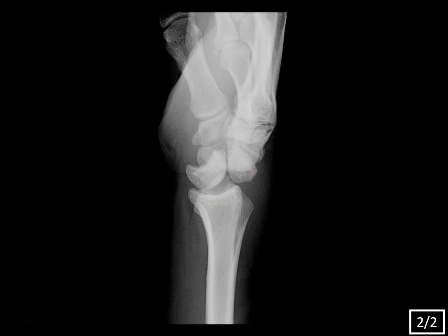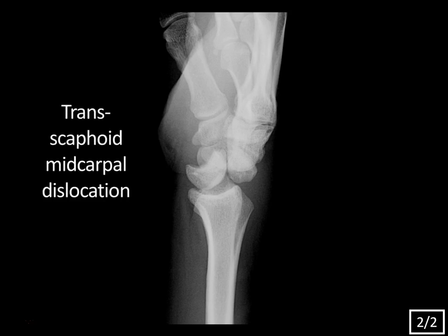You might initially think this is a perilunate dislocation, but look more closely at the lunate. Normally the lunate should point straight up and down in line with the radius, but here there's a volar tilt or volar angulation of the lunate, indicating the next stage — a midcarpal dislocation. Because we also have a scaphoid fracture, this is a transcaphoid midcarpal dislocation. In perilunate dislocation the capitate dislocates dorsally while the lunate still articulates with the radius. As the lunate tilts volarly, that's midcarpal dislocation. When the capitate moves proximally and completely displaces the lunate volarly, that becomes a lunate dislocation, where the lunate no longer articulates with the radius at all.